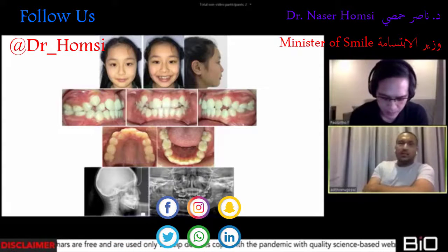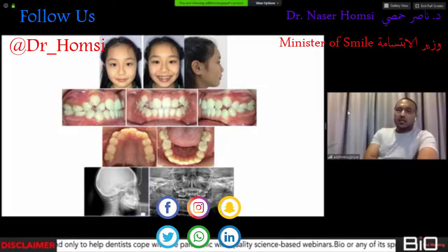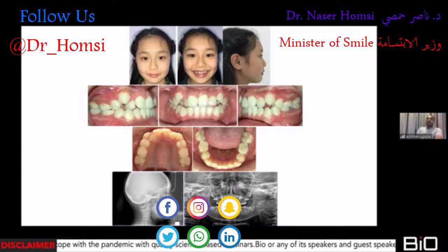Okay, so getting on to the clinical representation of such cases. One thing I would like to clarify is that my usage of self-ligation brackets is not based on the treatment. It's based on what the patient wants, and of course, I'll be honest here. Self-ligation brackets are more expensive than conventional brackets, and when we usually have a consult, I give them a particular treatment plan and I give them options, because for me, all the brackets are pretty much the same.